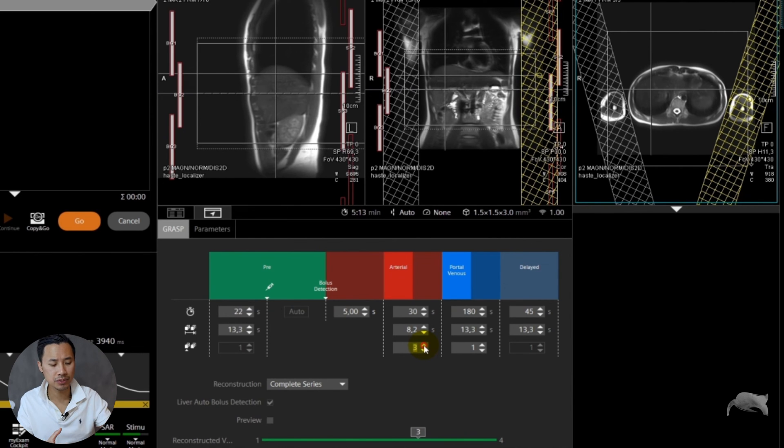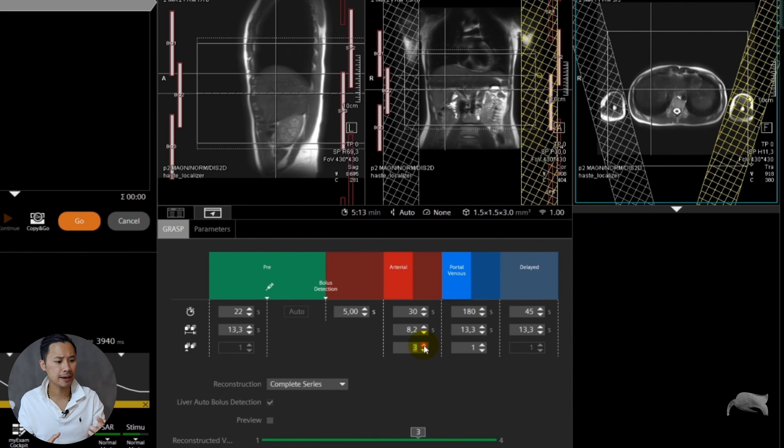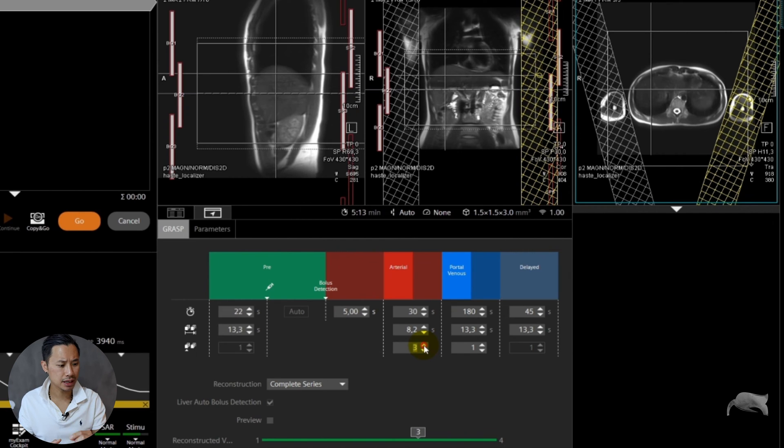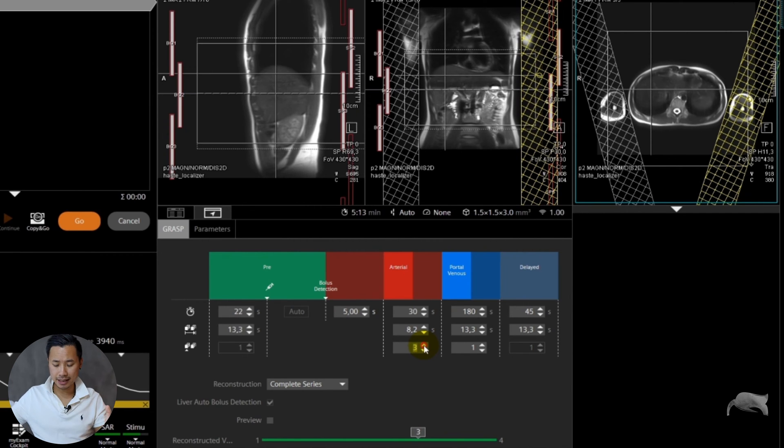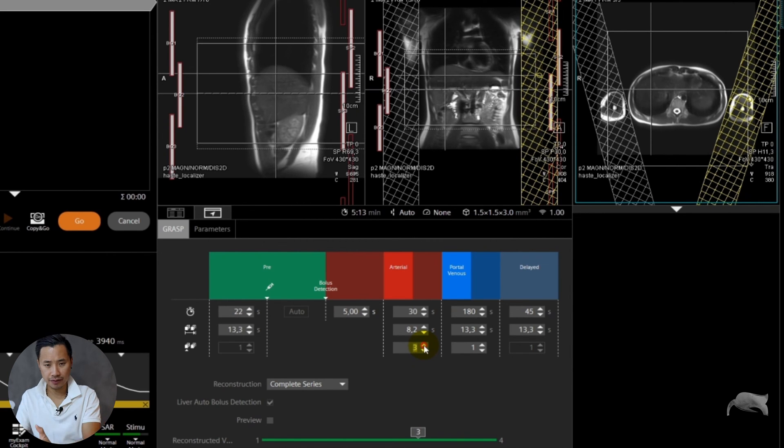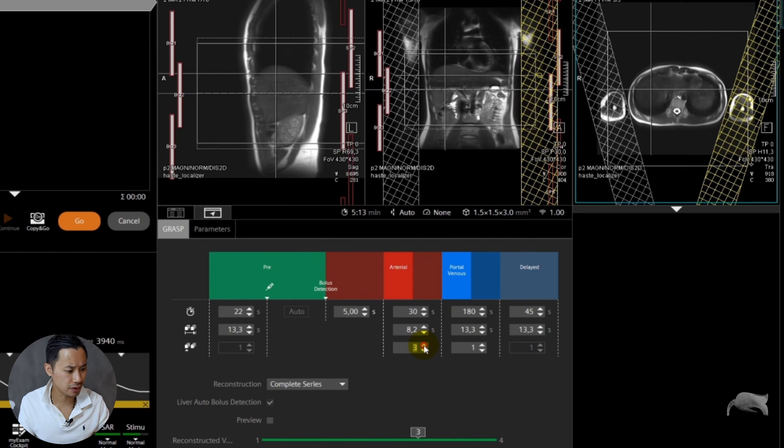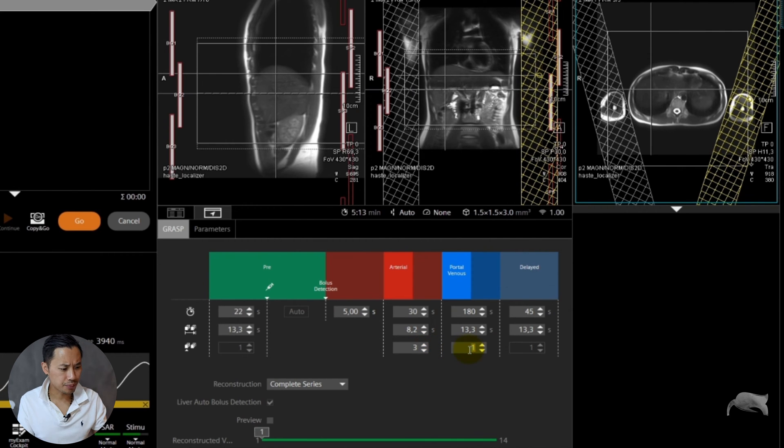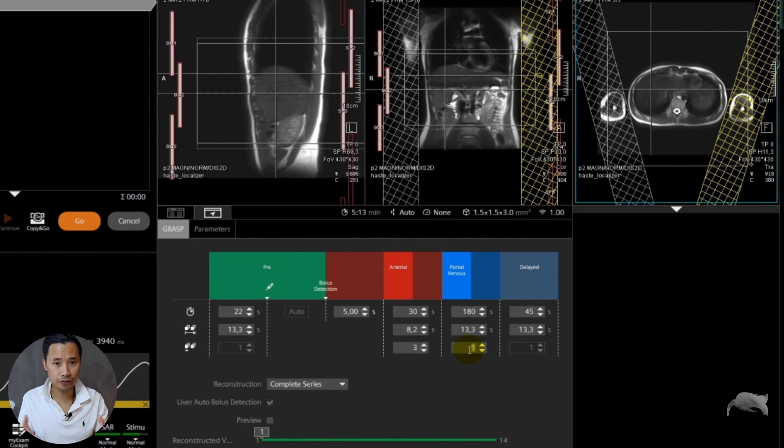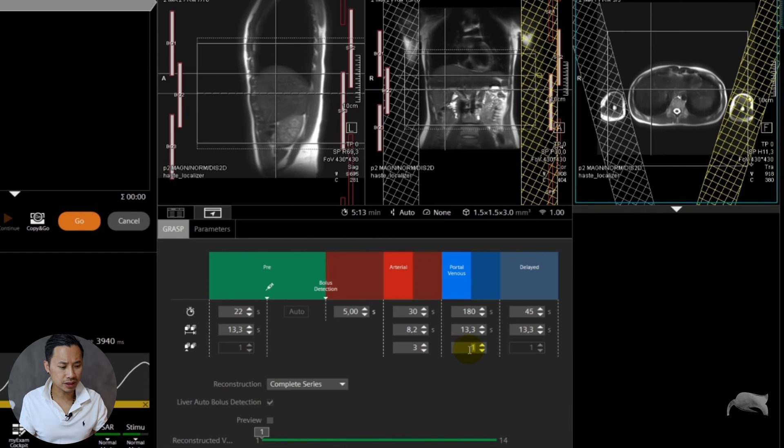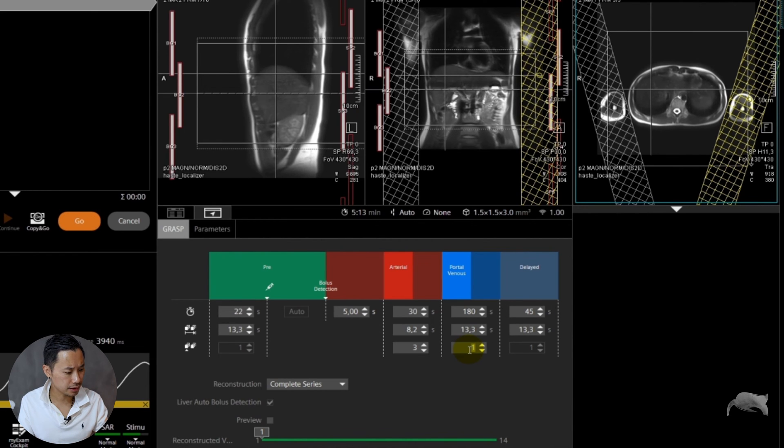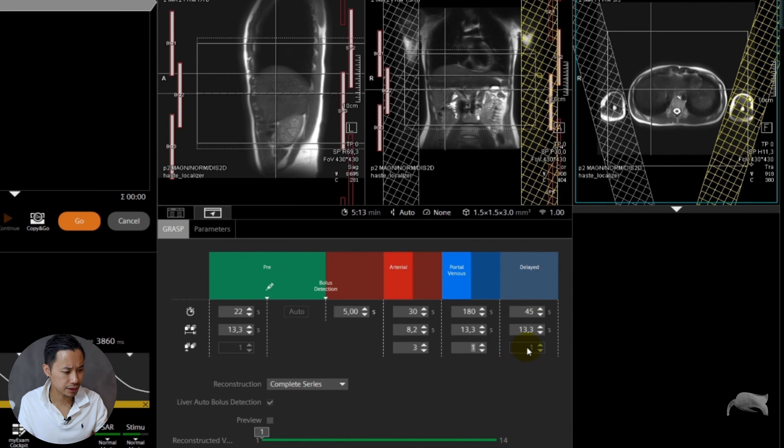If you have a high temporal resolution like 8.2 or five seconds, that means you are able to catch hypervascular focal liver lesions. Instead of scanning 20 seconds, you scan five seconds, five seconds, five seconds and then you will catch the lesion. You can see the portovenous, the PV, you have room for 14 but you don't need 14 portovenous phases. You only need one, that's what your radiologist is used to, and then you have one delay.